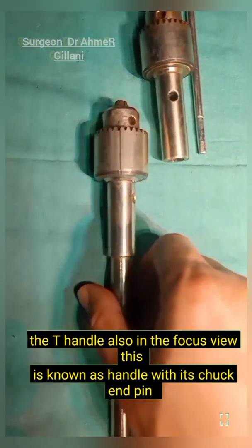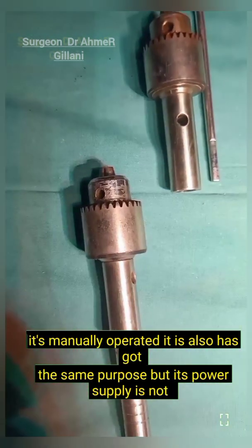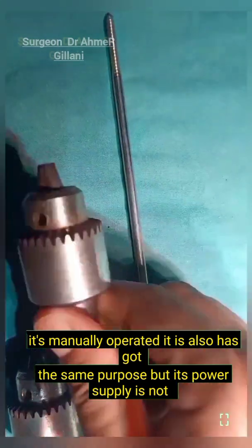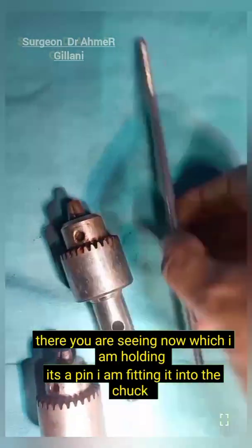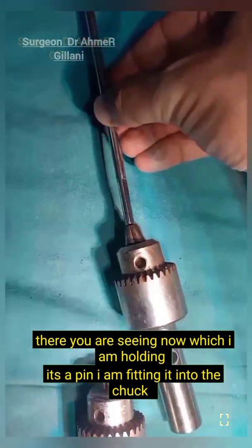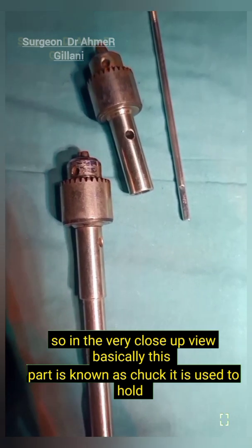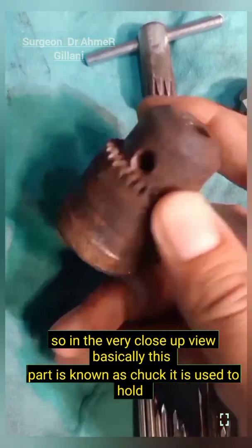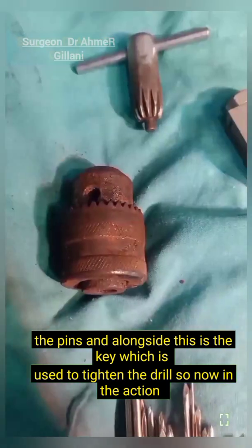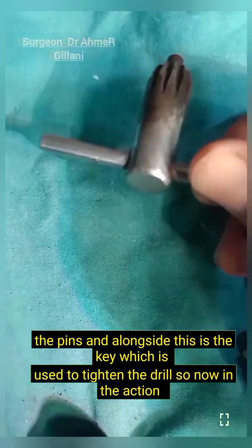This is known as the handle with its chuck and pin. It is manually operated and has got the same purpose as the drill, but it has no power supply. You are seeing the pin which I am holding — I am fitting it into the chuck. In close view, this part is known as the chuck. It is used to hold the pins, and alongside this is the key which is used to tighten the drill.